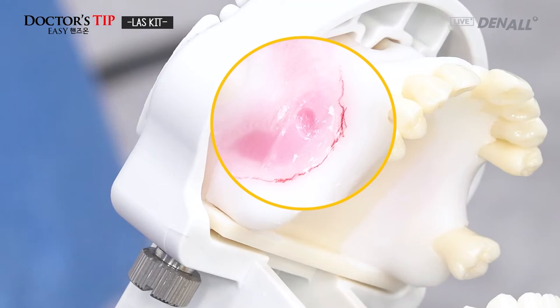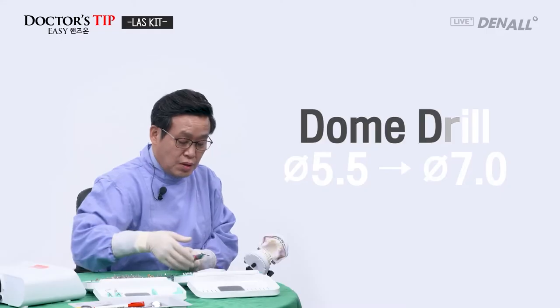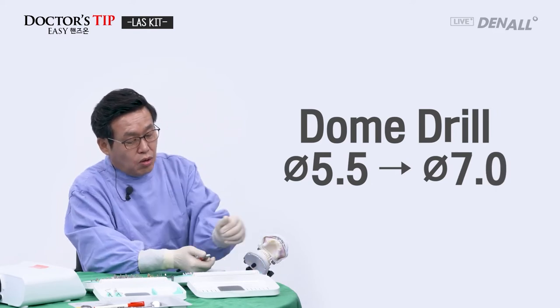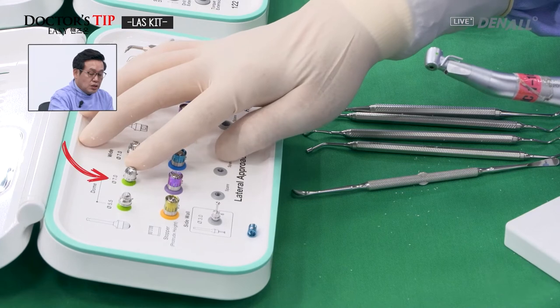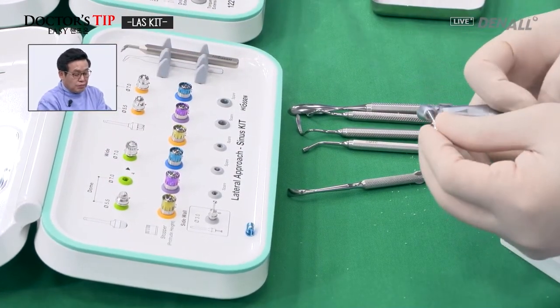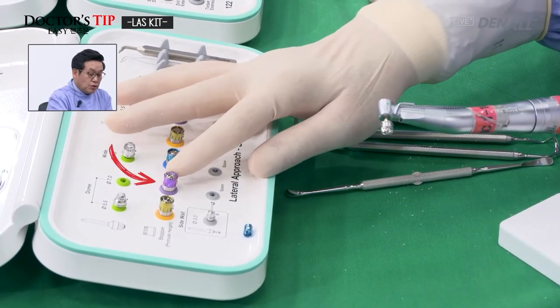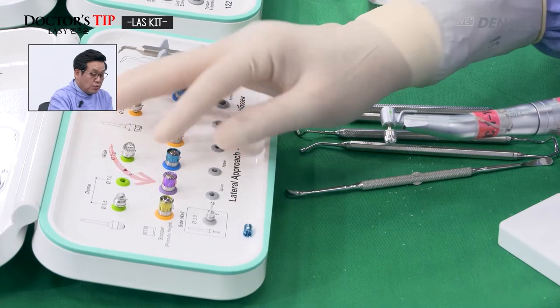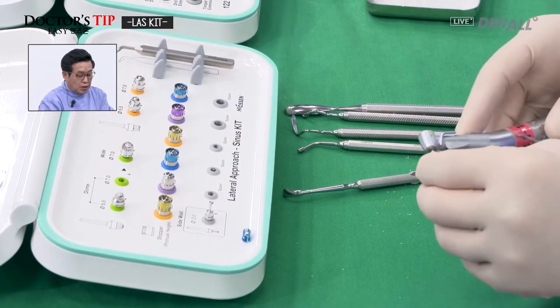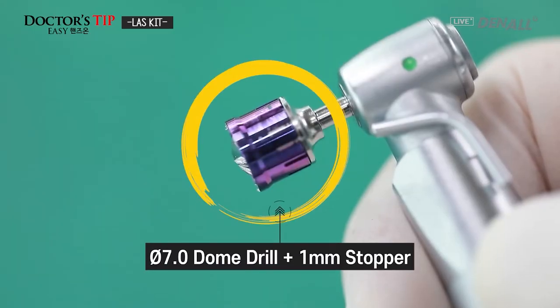So you see the diameter is a bit on the narrow side. So the dome drill will switch from 5.5 to a bigger one, a 7.0 diameter dome drill. Then again, for the stopper, we will first use the 1mm stopper. So mount that stopper. So drill, you see a bit protruding.